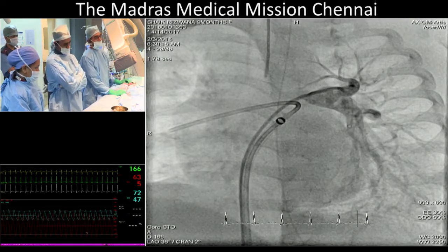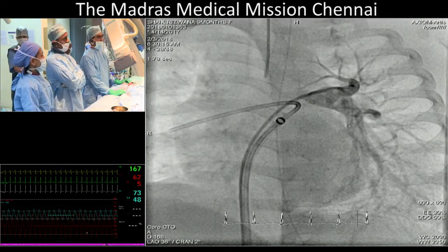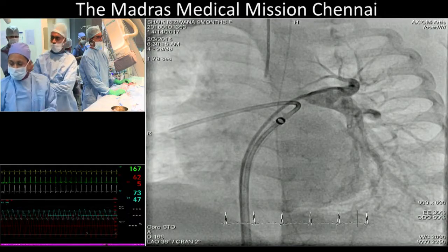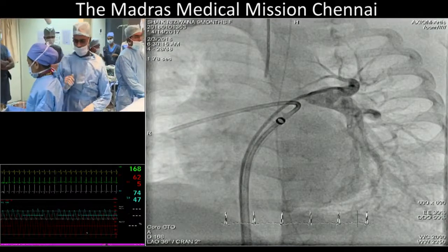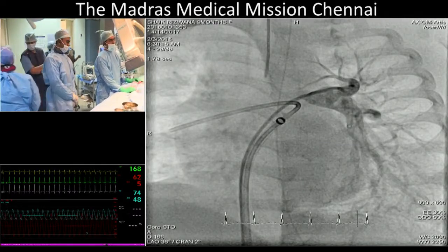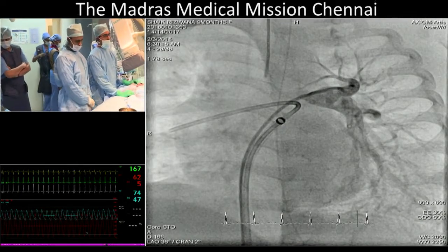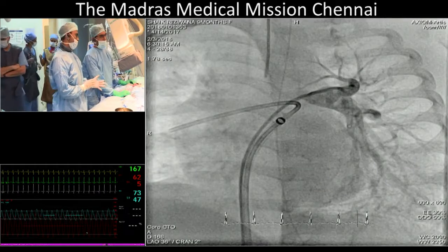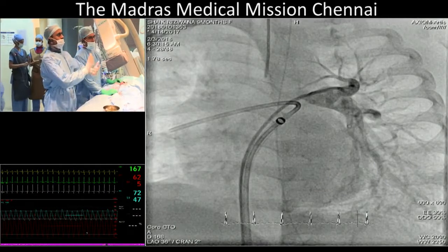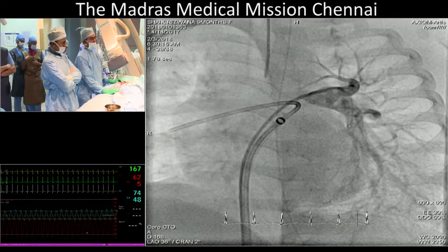The natural history for Williams syndrome patients is usually that their branch pulmonary artery stenosis and their pulmonary valve stenosis actually get better over time. If you intervene too much, they actually get worse. A lot of the time you can tolerate higher pressures and follow them. They may get better. I agree with Dietmar that the left PA, that tiny stenosis, is balloonable, but there could be a risk of causing pulmonary edema and all that on the contralateral side.